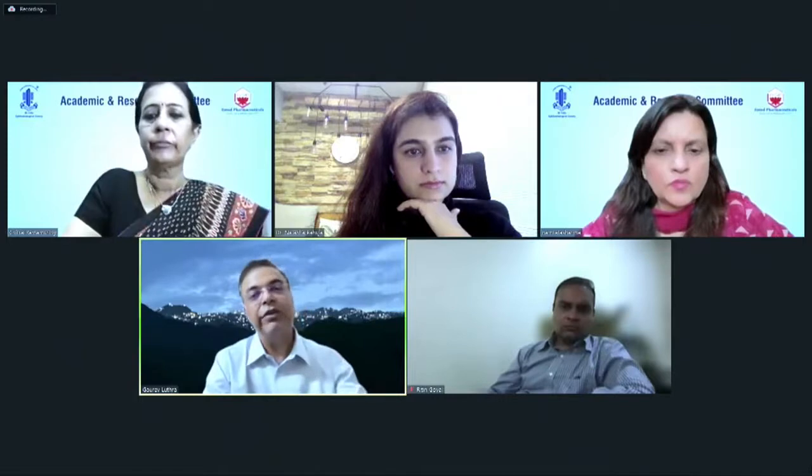Dr. Gaurav, you want to add something? Yes, ma'am, I think TREC is different from topography guided treatment on the Alcon platform in that it works on a very small decentered zone. TREC is basically trying to just flatten the cone a little bit. That's why you get away with just doing about 10, 15, 20 microns, because you're not really addressing the whole topography and you're decentering it to fire on the cone itself. Whereas a full topographic ablation, as happens on the Alcon platform, is also trying to raise some areas and press the cone, making the cornea more regular.